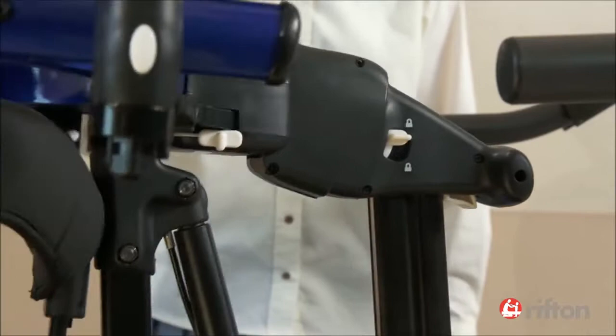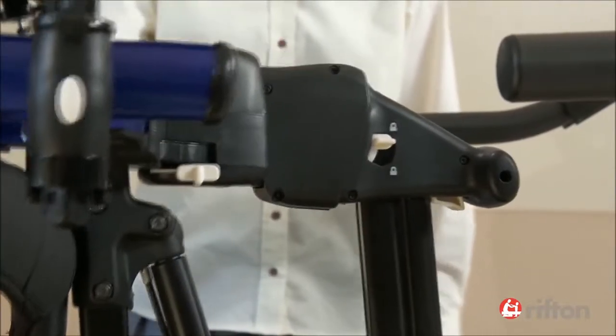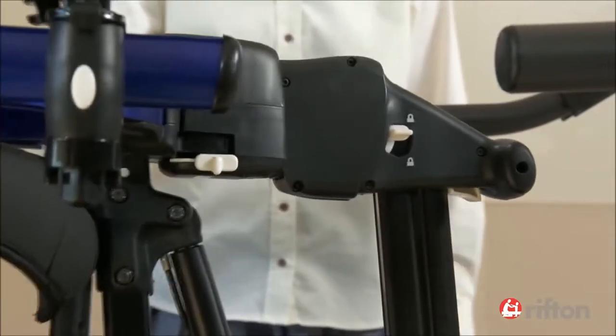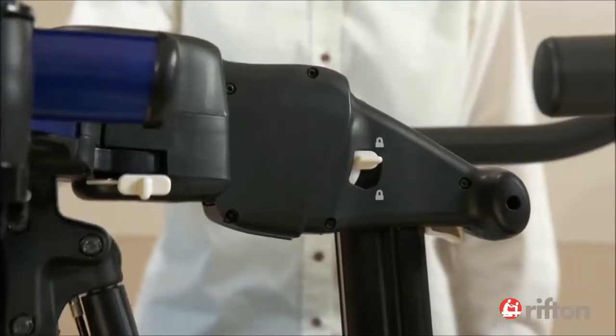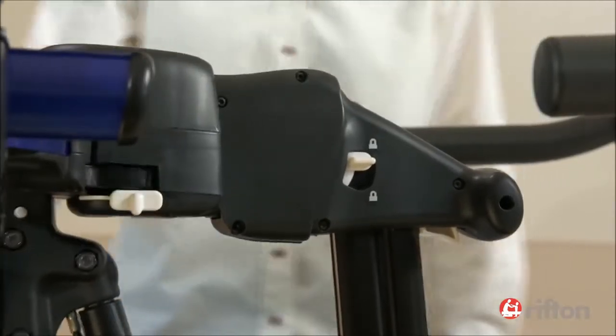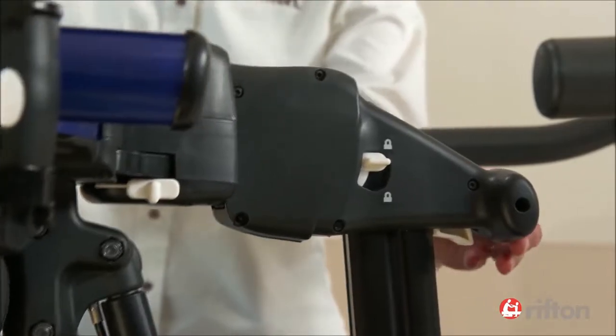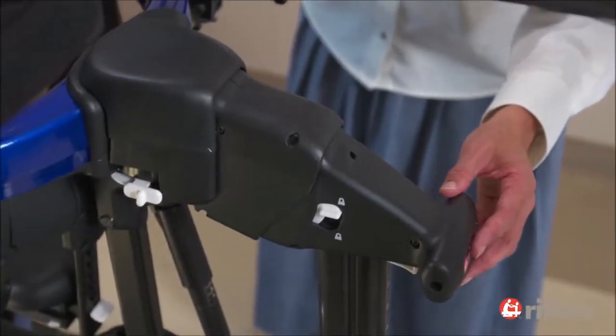The side-to-side movement allows for up to 2 inches of horizontal movement. This lateral freedom allows Scott to shift his weight from one limb to the other. The up and down movement allows Scott to move his center of gravity vertically and assist weight bearing, so that the opposite limb can swing through more easily.